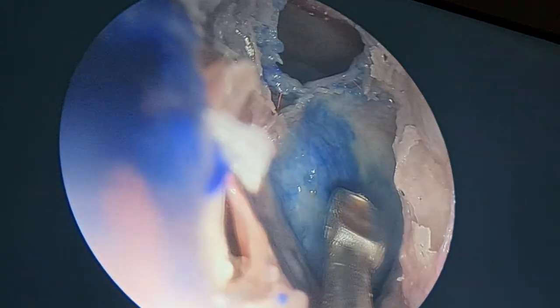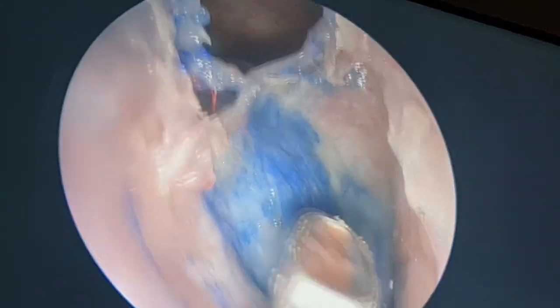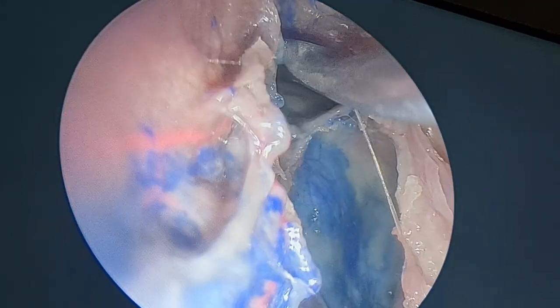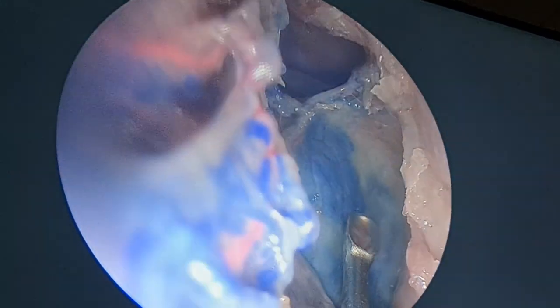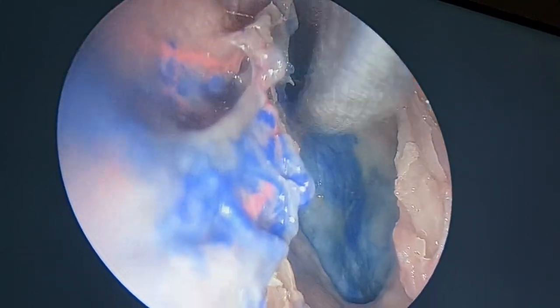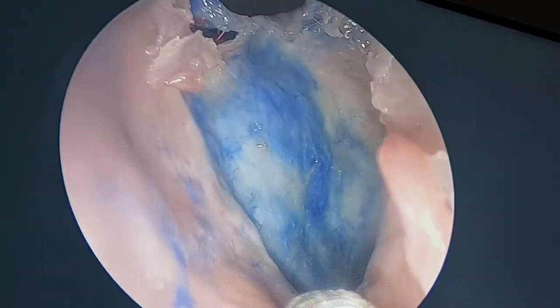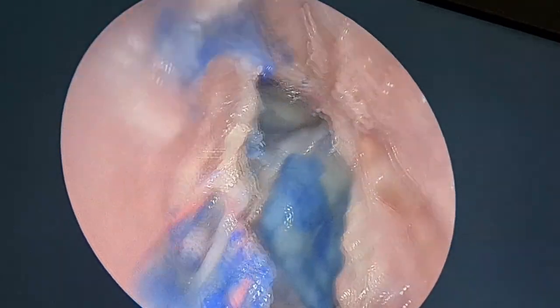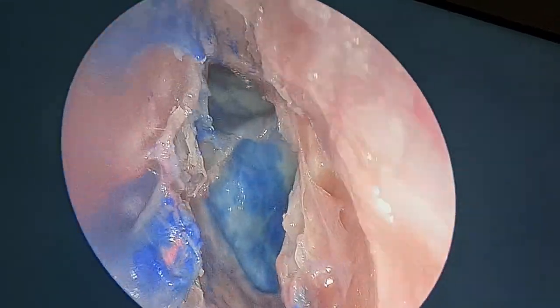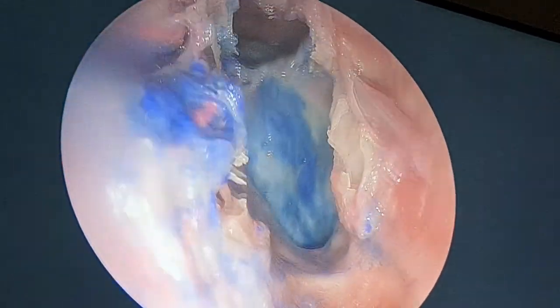This is a supraorbital recess. And see, this recess is going above the orbit. This is the orbit here. This recess is going above the orbit, that's why we know it as the supraorbital recess. And this is always behind the frontal sinus. The anterior most is the beak, then the frontal sinus, and then behind the frontal sinus is the supraorbital recess. Once you find the supraorbital recess, that's great anatomy. Immediately caudal to the supraorbital recess is the anterior ethmoidal artery. The more the supraorbital recess is pneumatized, the more the anterior ethmoidal artery is pushed behind.